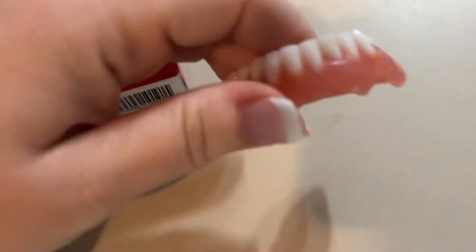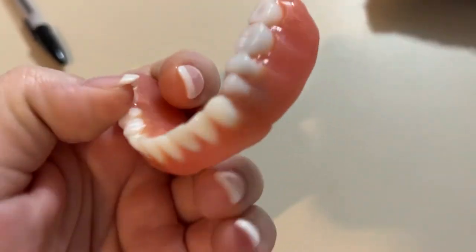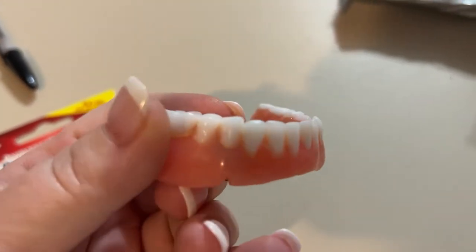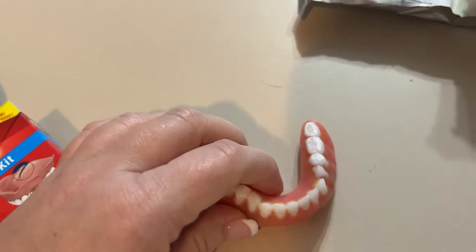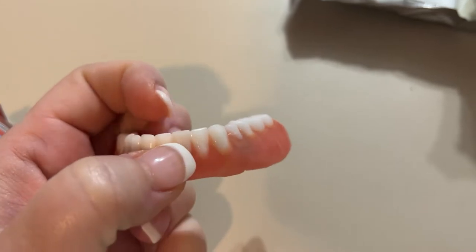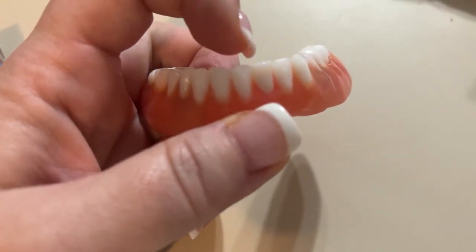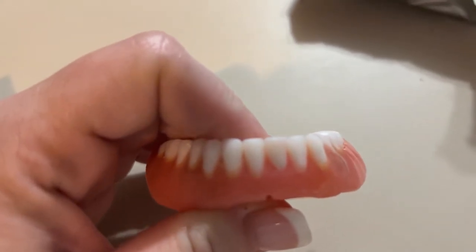Here's the denture in question — it's my lower. As you can see it looks just fine, but what I noticed — I was chewing on a piece of ice, which I probably shouldn't do — my tongue caught a sharp edge on the front row here. And that is this tooth right here. I don't have a tripod — why don't I have a tripod for my phone? I'm so unprofessional. Let me find something to lean this against.